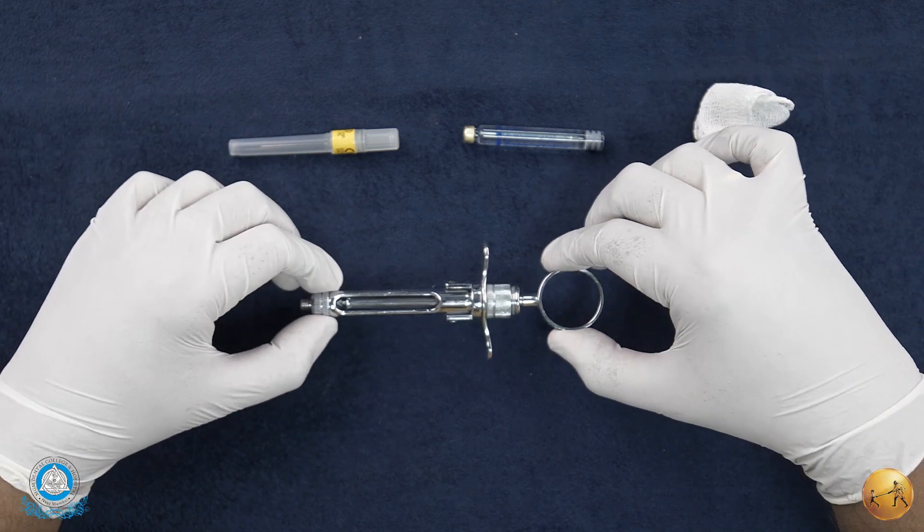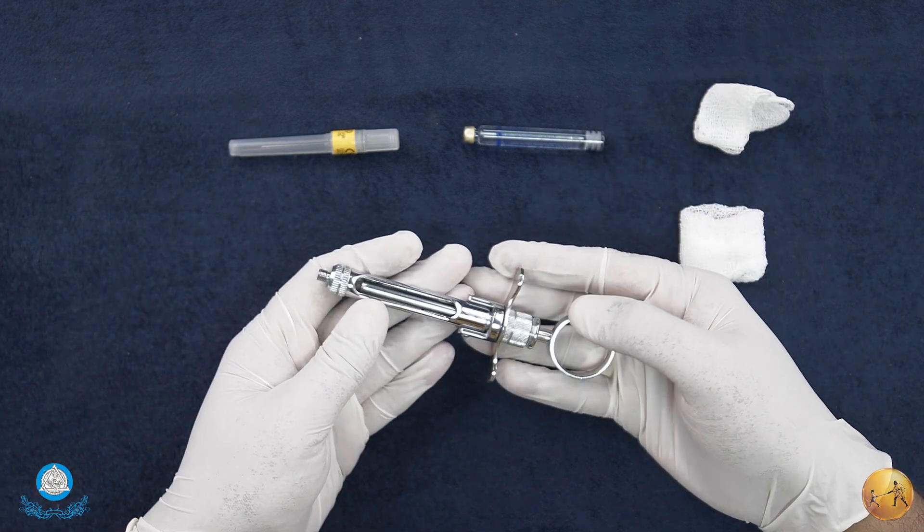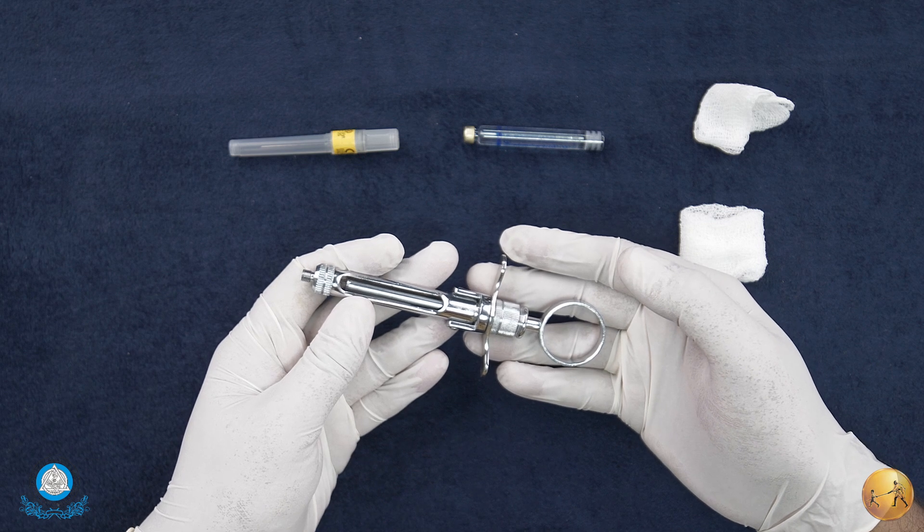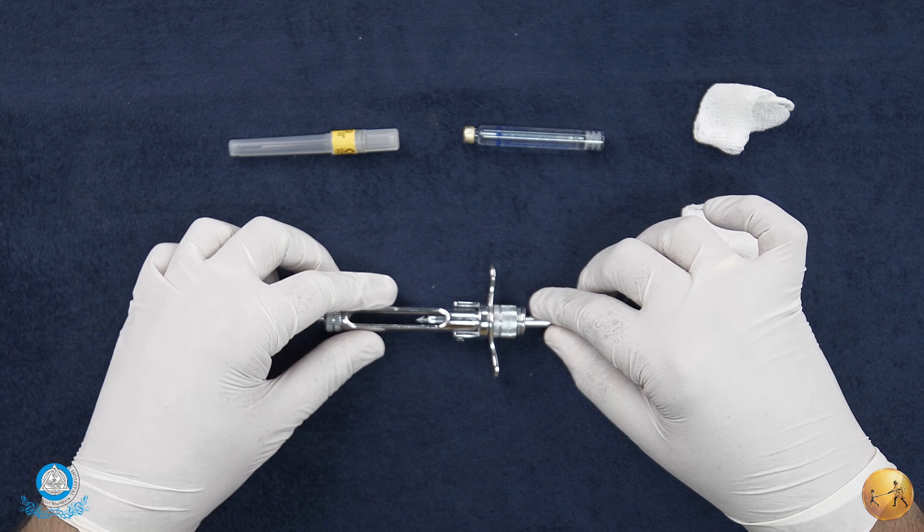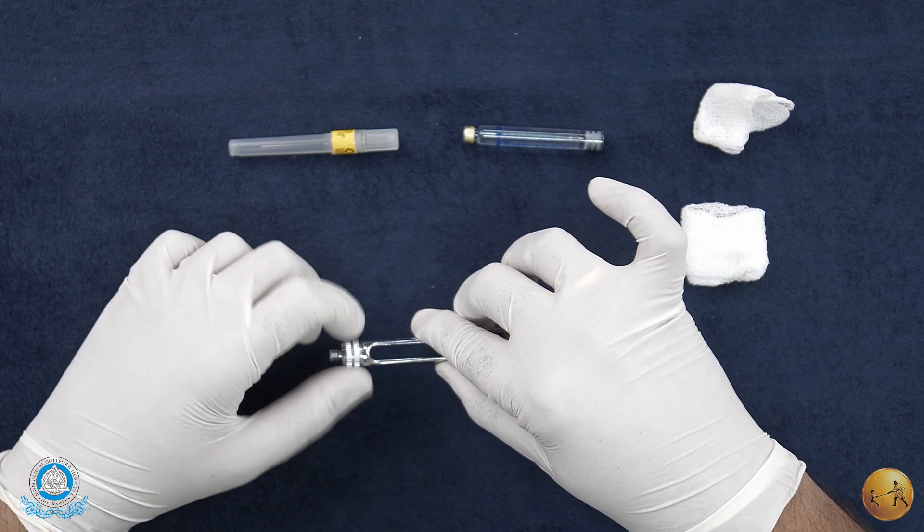To start with, we'll first talk about the actual syringe. This is what the syringe looks like - this is a fully sterilizable unit. Now let's quickly talk about the parts of a syringe. I'll just disassemble this once.